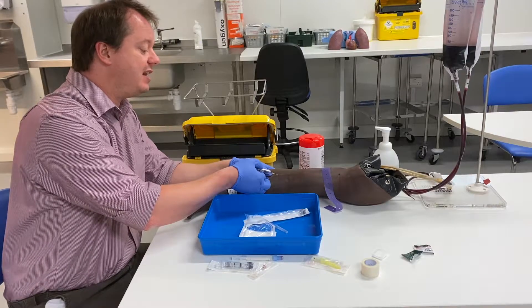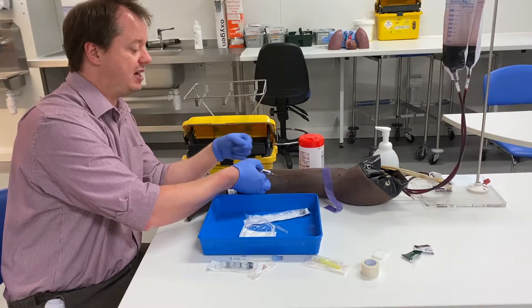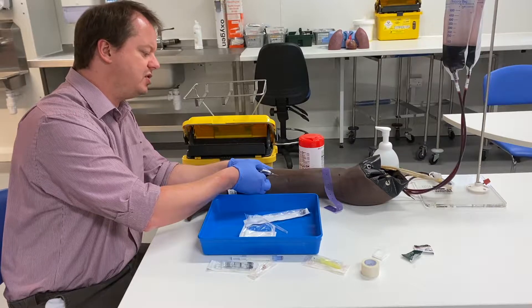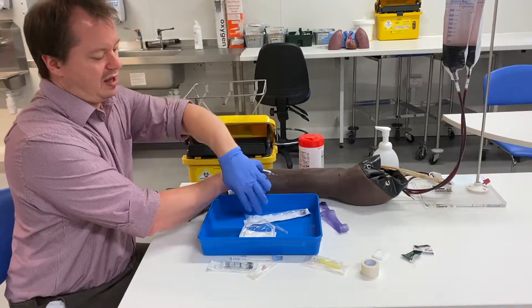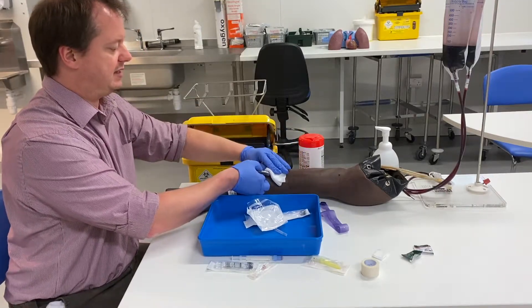It will fill at a slightly slow rate, but it will automatically fill up and keep filling providing that vein is under pressure. If you stick the needle in and nothing came out, you can release the skin traction and aspirate the blood out, but that can make the test a little bit more difficult. So it is good to allow it to autofill by itself, wait for it to fill up, and then once it's done that, release the tourniquet, use your gauze, cover the wound, and take it out.